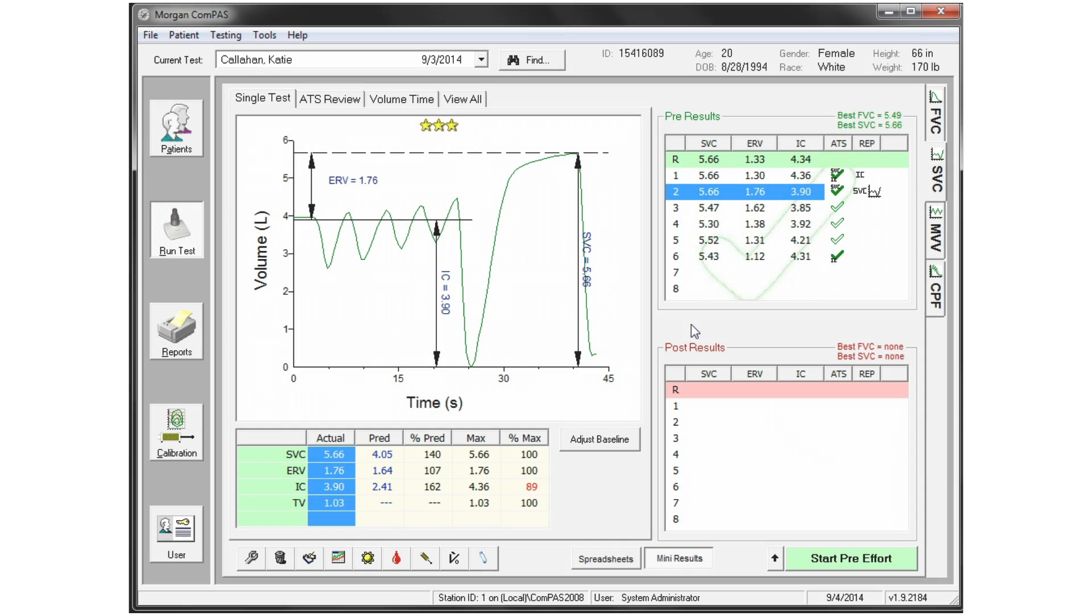Once an SVC test has been completed, the computer will look for the tidal volume data and establish automatically where it considers the FRC baseline to be.